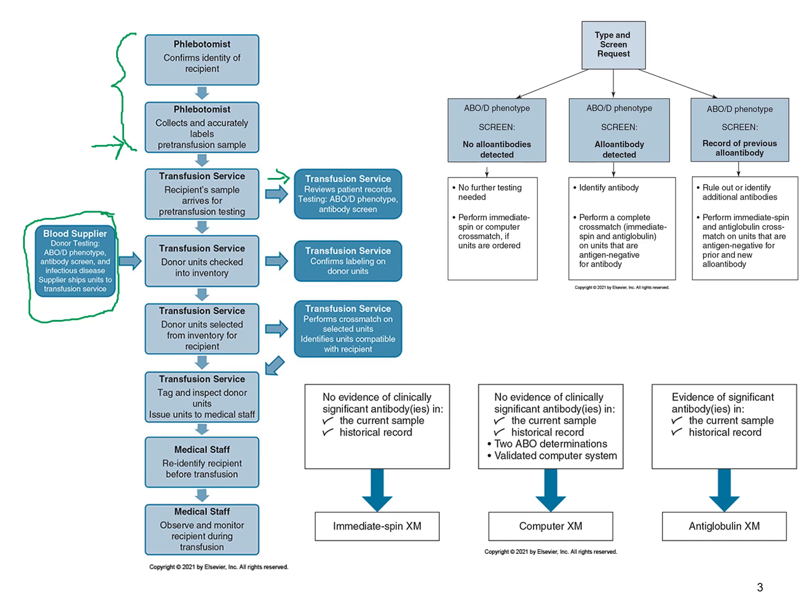So you will do a donor recheck, looking for the blood type. You're typically just going to do an A and a B. If it's an O, you could screen with anti-AB, but you're basically just going to be checking that type. If they are Rh negative, then you would run an anti-D just to make sure that they really truly are D negative before you put that into your inventory. So you're going to do all the checks that you've got to do to put the unit into your inventory.